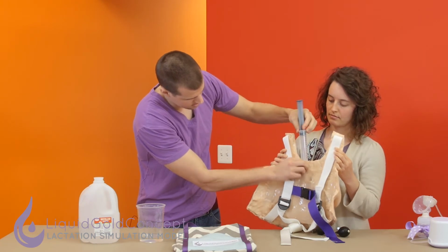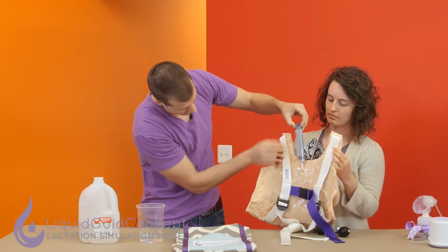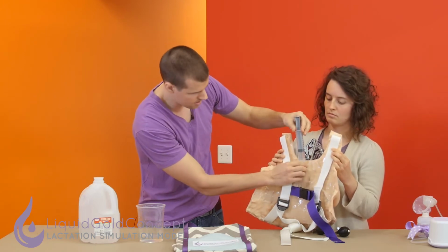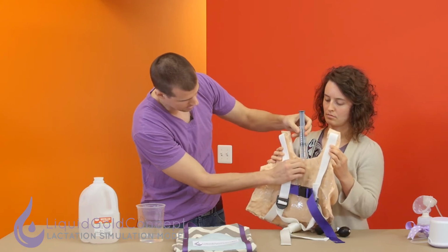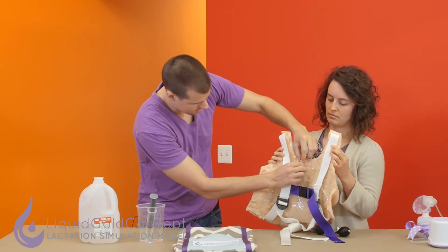Connect it, add some more water. So again, I'll check and see if it's full. And since I'm pulling back water, I now know that it's full and I don't need to add any more. So I'll pull back a little bit so it doesn't spill out too much. And again, that's why we just use distilled water so we don't make a mess. And I'll put the cap back on.